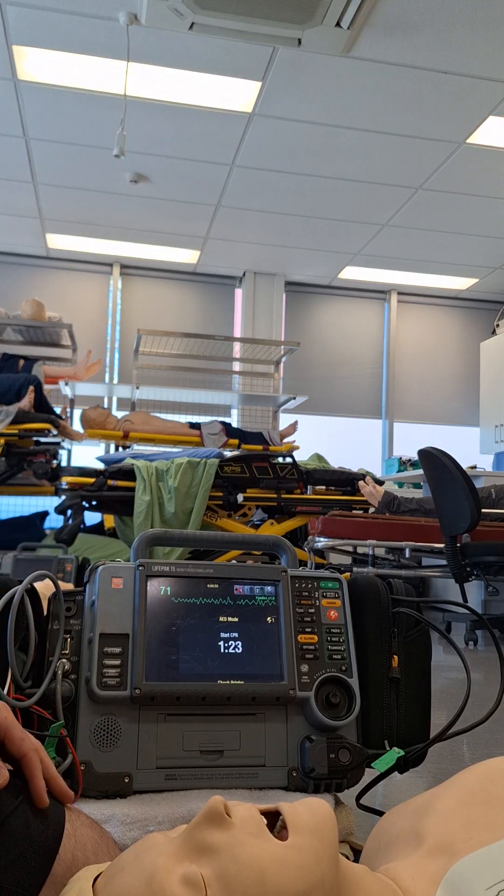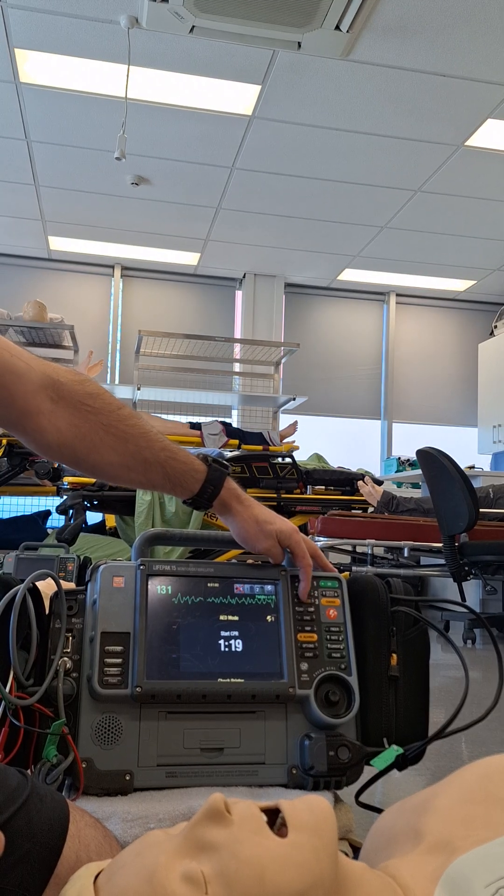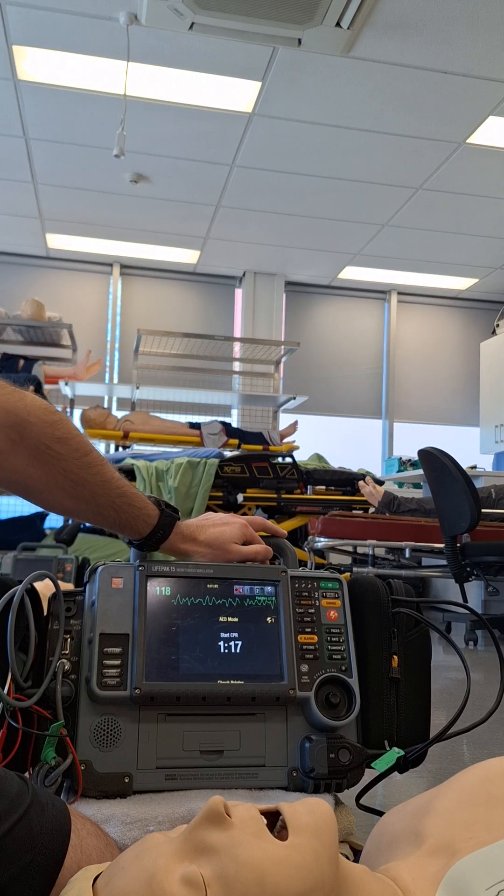And at the end of this cycle, the monitor is going to prompt us to push that Analyze button again. So there's a manual input required, which is a little bit different from the Zoll.